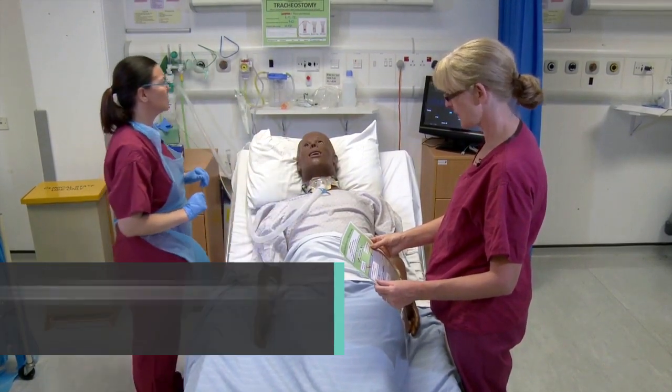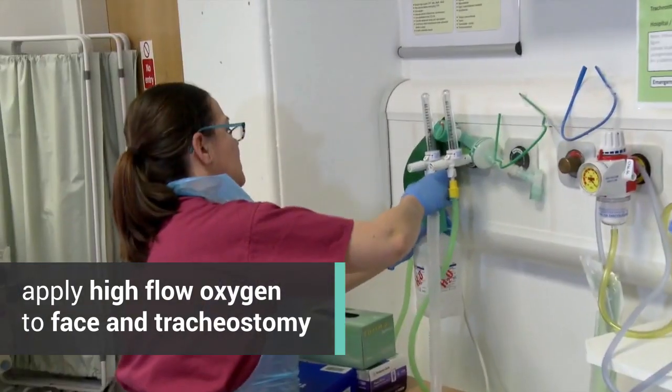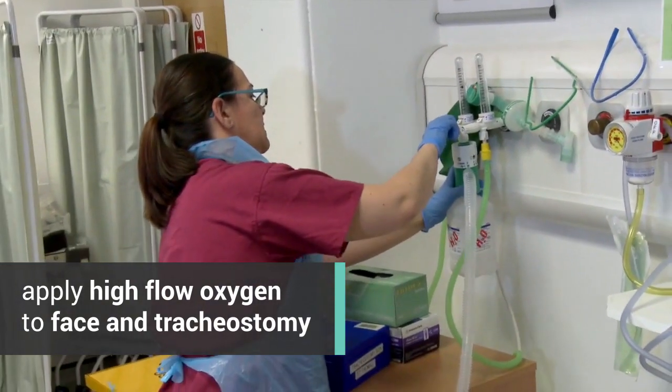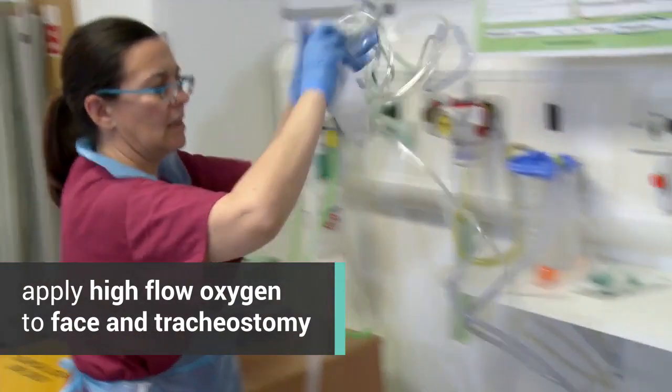I've still got the cuff up. Okay, we need to put some high flow oxygen onto both the trackie and his face. So he's on 60% just there with the trackie, and then 15 litres through the mask.